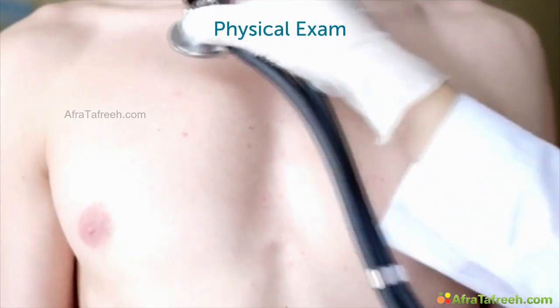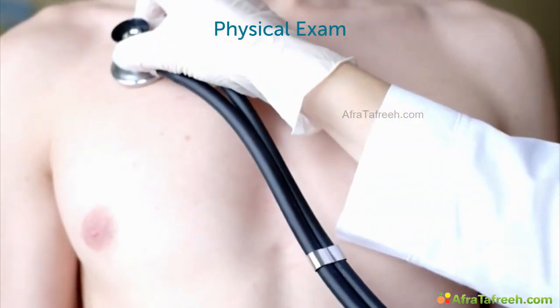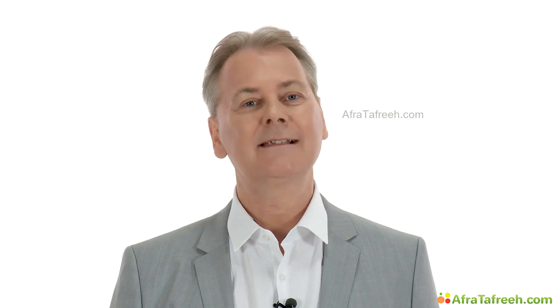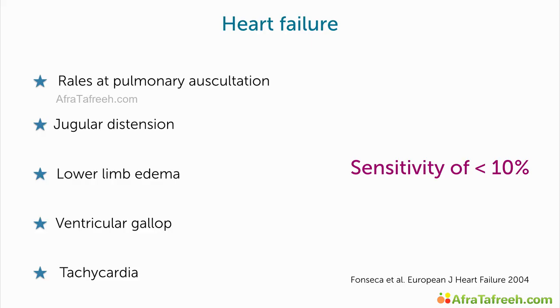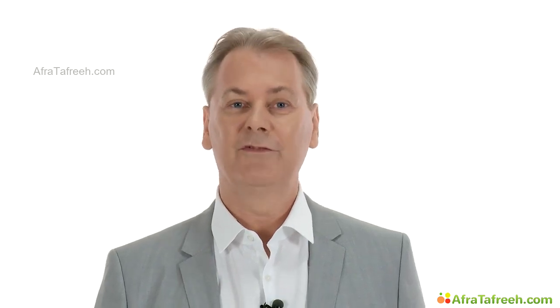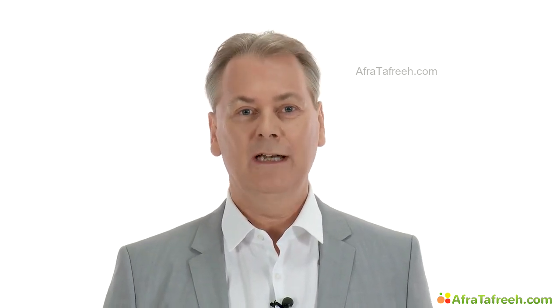But what about the physical exam? How helpful is it really in detecting patients with heart failure? The sobering fact is it's not very good. It has a sensitivity of only 10%. Maybe you might be able to detect forms which are more severe with a higher sensitivity, but in the overall population, these are the facts. Even if you take all the findings together, rales at pulmonary auscultation, jugular distension, lower limb edema, ventricular gallop or tachycardia. Now, I'm not saying you should not perform a physical exam. It will be complementary, but with the help of ultrasound, you'll be much quicker and you'll get much more out of the exam.